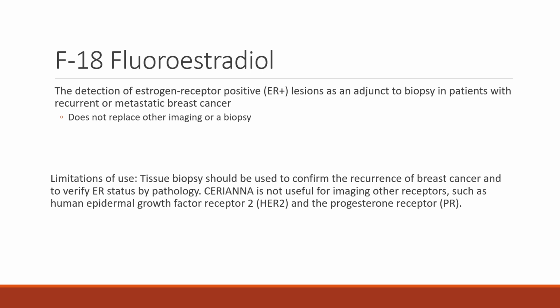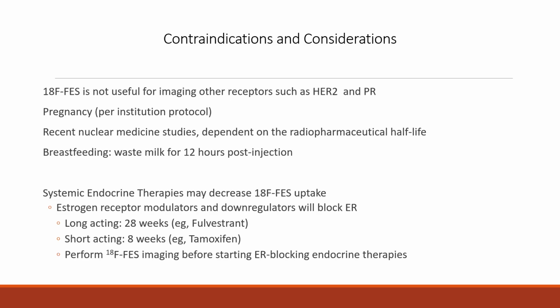And Cerianna is not useful for imaging other receptors, such as the human epidermal growth factor receptor 2, the HER2, or the PR, which is the progesterone one. So only estrogen receptor positives. Contraindications and considerations: it's not useful for imaging other receptors, which I literally just said.